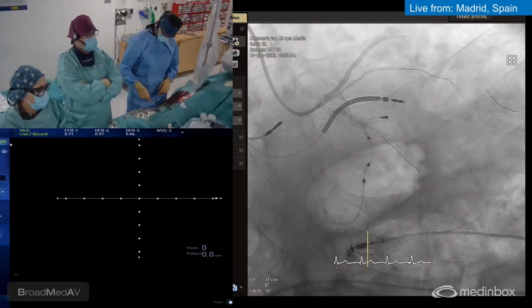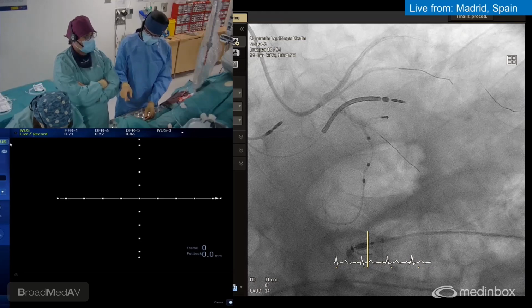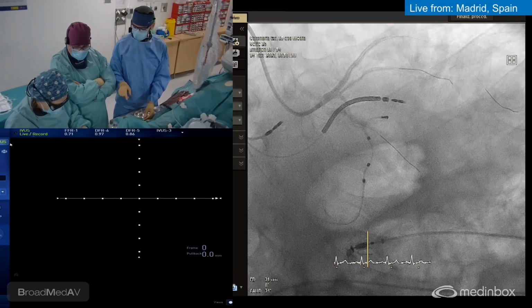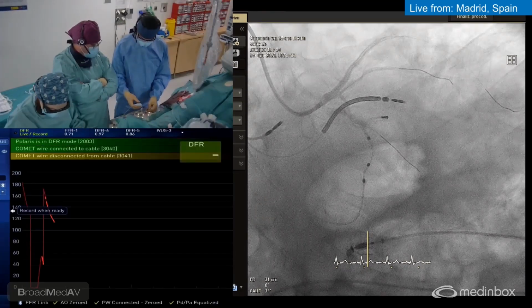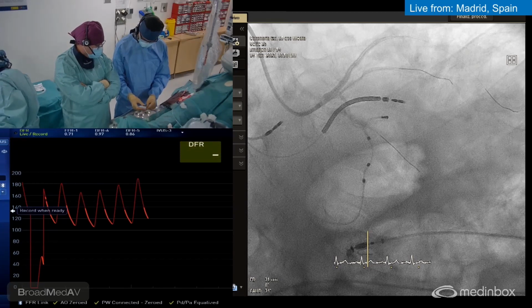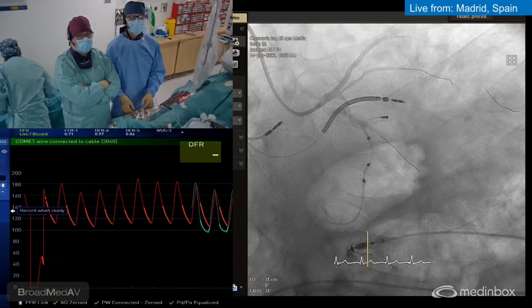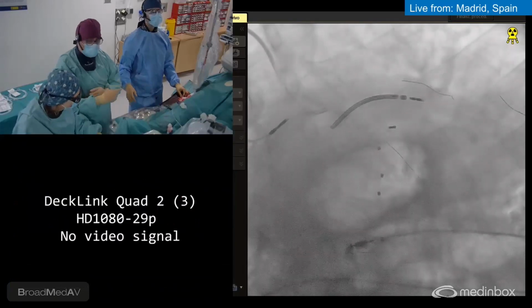Let's measure the DFR again. We know that... Ponemos el IVUS. Déjame la guía de presión un segundo. The functional measurements after a PCI are not always a good thing because it's difficult to interpret the results. ¿Me dais agua, por favor? ¿Rellenáis con salino? Salino.